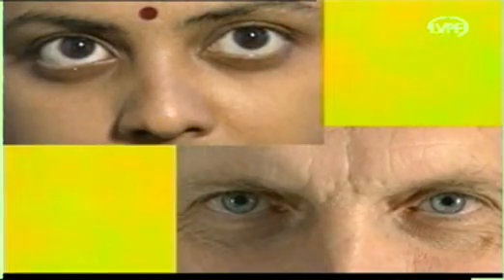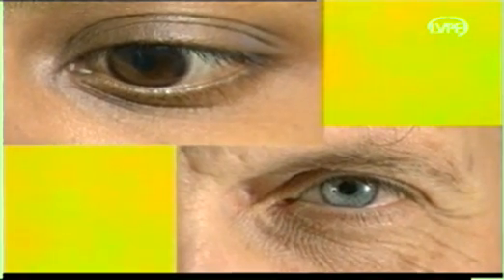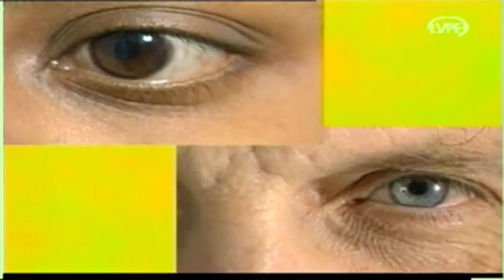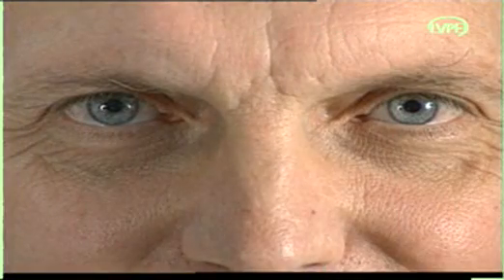It is difficult to penetrate dark brown iridis with argon laser because they have a tendency to char during treatment, and light blue iridis can be difficult because pale iridis do not absorb laser energy very well. As the pulsed Nd:YAG laser has no coagulative effect, bleeding occurs more frequently.